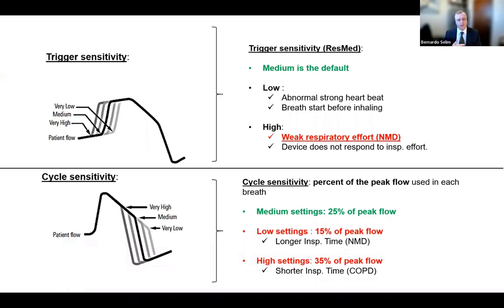And you'd ask me, do you really change the trigger in your patients? Most of the time I don't. But sometimes when I have neuromuscular disease patients that have problems to initiate the breathing, I make that initiation of the breathing easier. Therefore, I put my sensitivity to be higher.